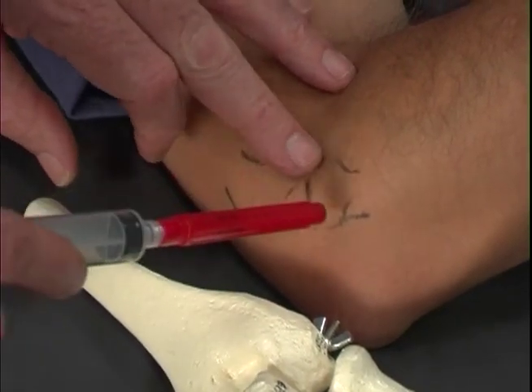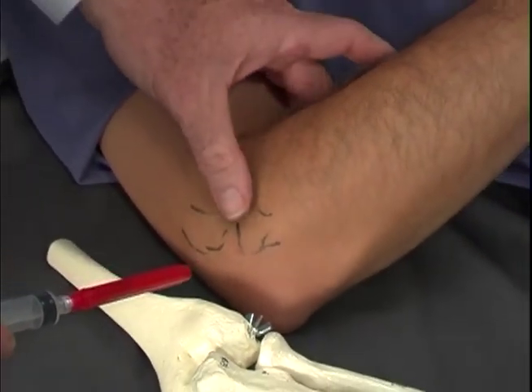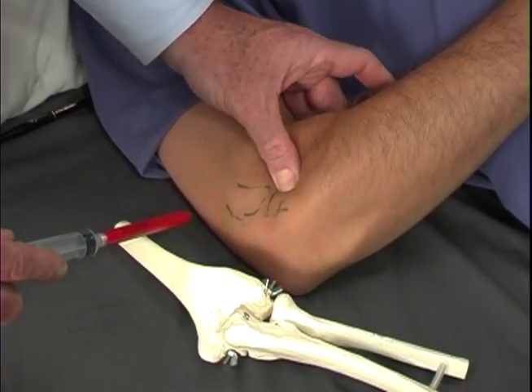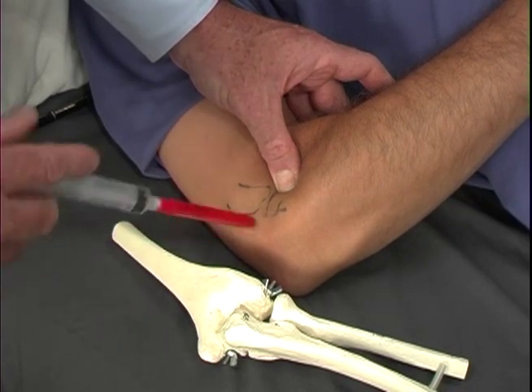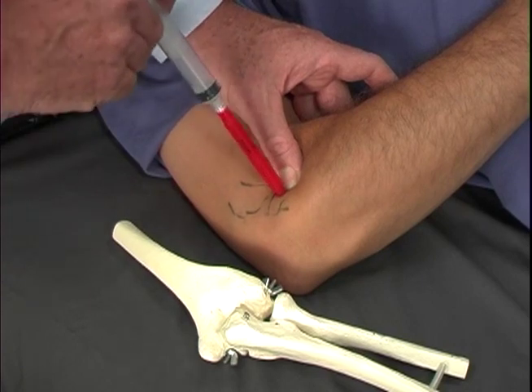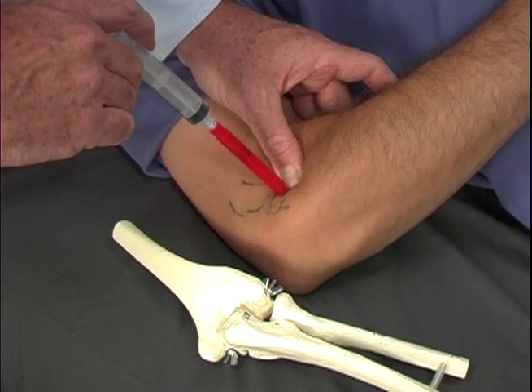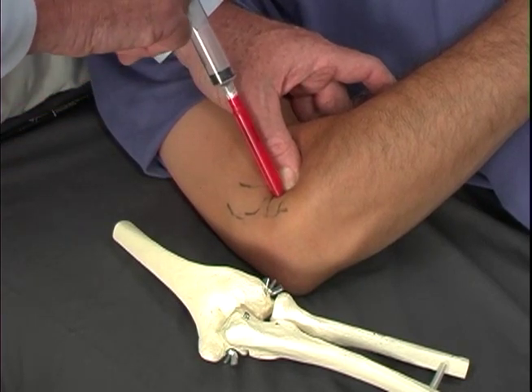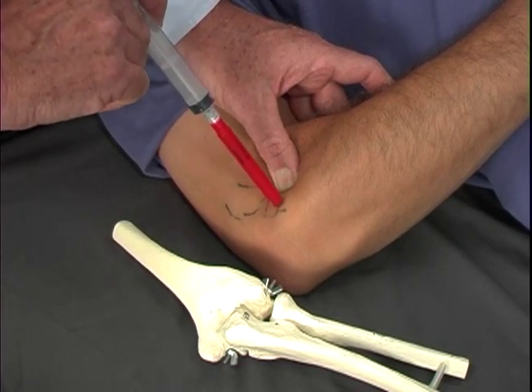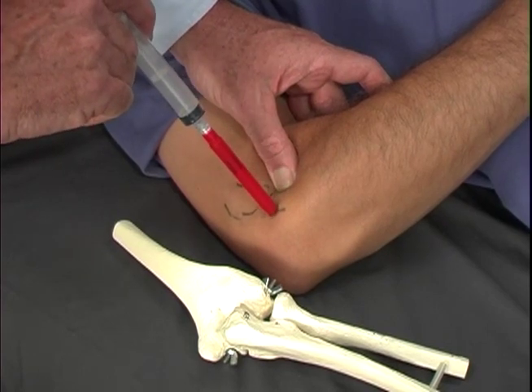When we're doing the radial head injections, I generally do this with the arm bent at 90 degrees, and then I push the musculature medially to push the radial nerve out of the area, and then come downwards, being careful to avoid a medial direction where I might drop off into the medial space and inject the radial nerve. Come straight downwards onto the radial head, and again peppering that radial head to cover the annular ligament that rides over the radial head in that area.